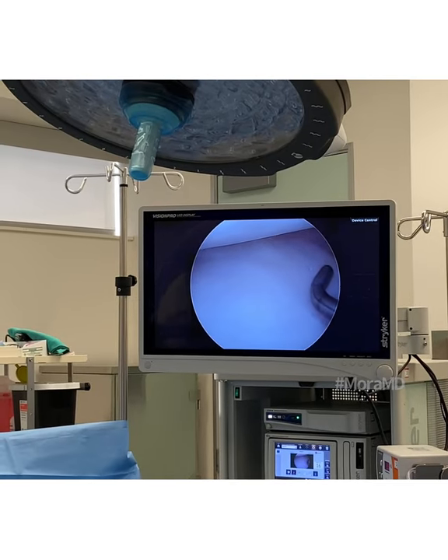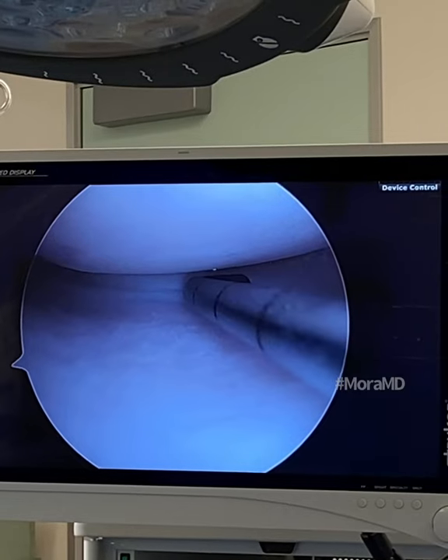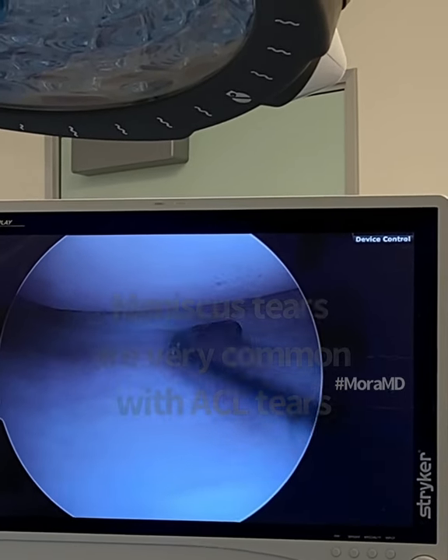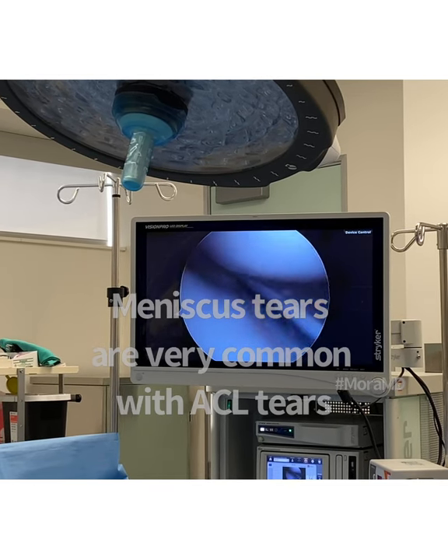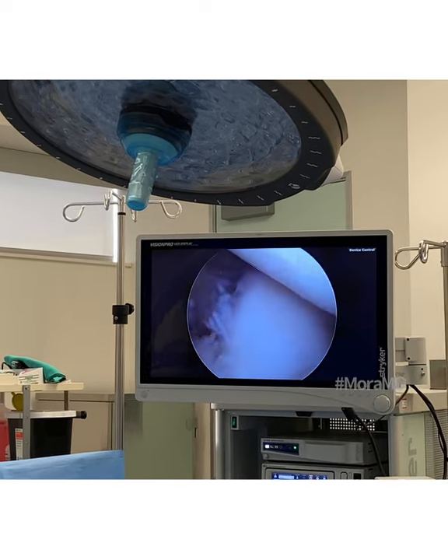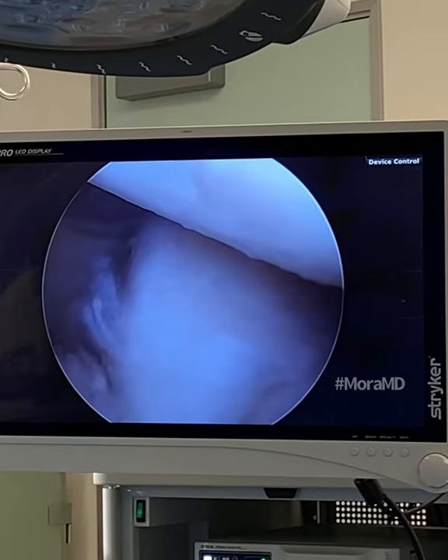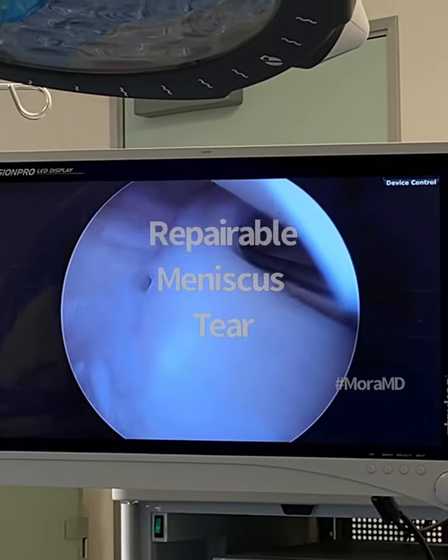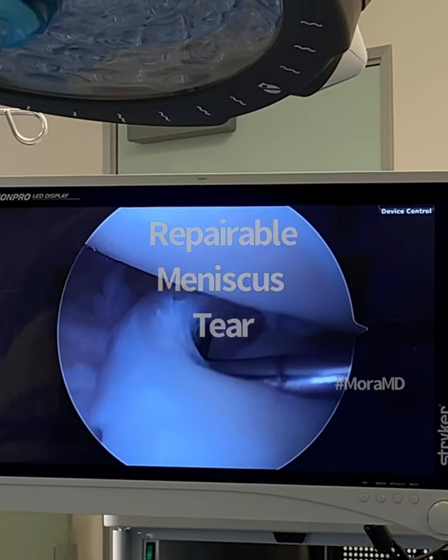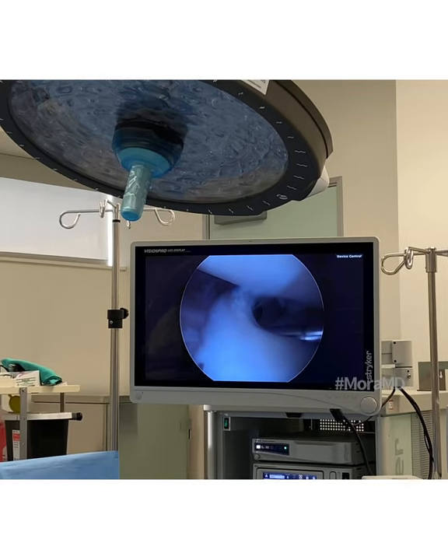Let me show you what we did. I looked at the meniscus, and way in the back I noticed a little area that looked like it was buckled right there. The tear is actually hard to see, so I went to the posterior view — the root of the medial meniscus is right there, the root is okay. Using a probe, there's a tear way back there, most likely within the vascular zone.